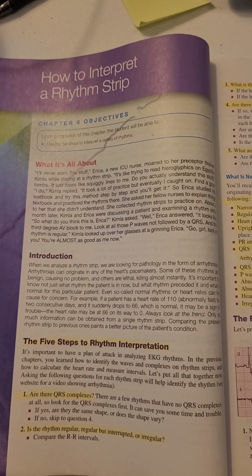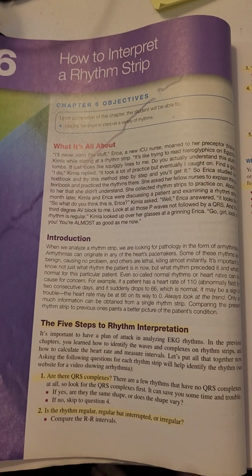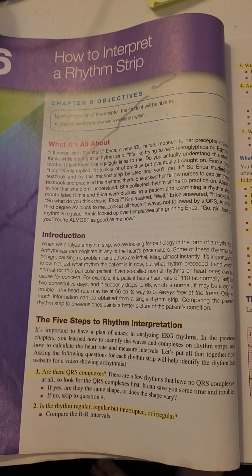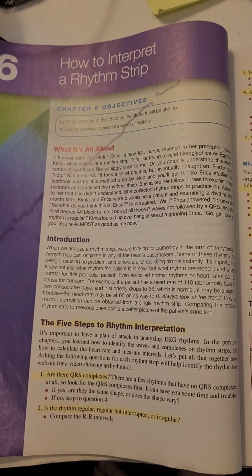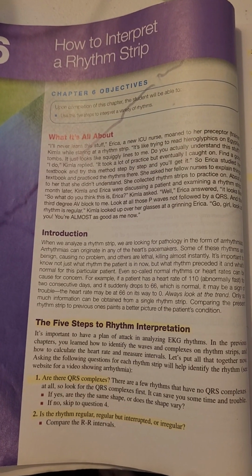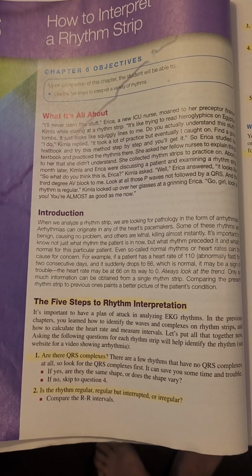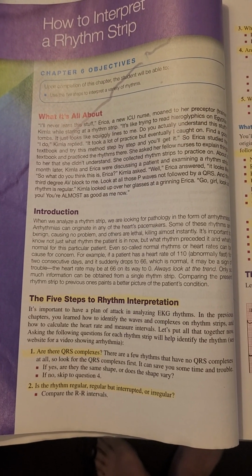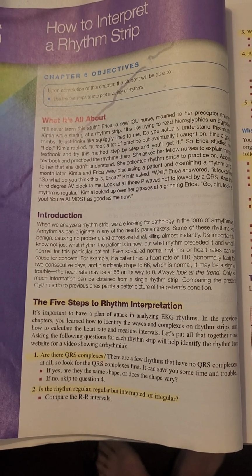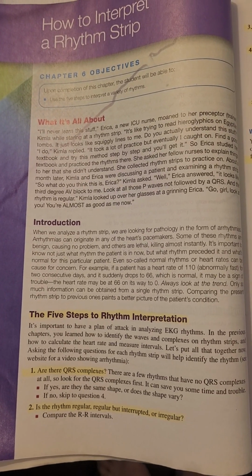Always look at the trend, what they're running. Only so much information can be obtained from a single rhythm strip. Comparing the present rhythm strip to previous ones paints a better picture of the patient's condition. In the previous chapters, you learned how to identify the waves and the complexes on rhythm strips and how to calculate the heart rate and measure intervals. So, like it's saying right here, now we're going to put it all together.